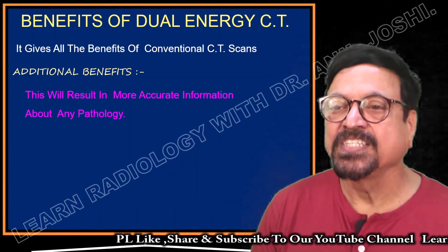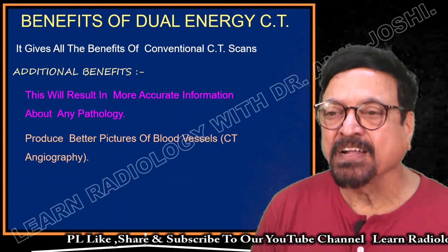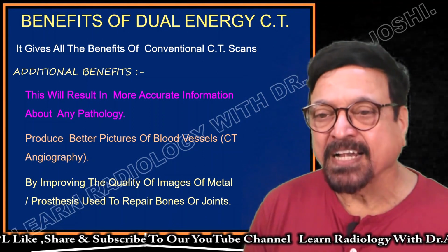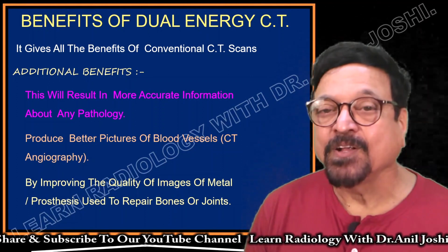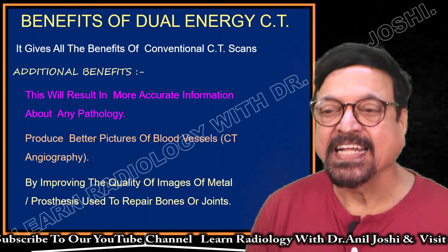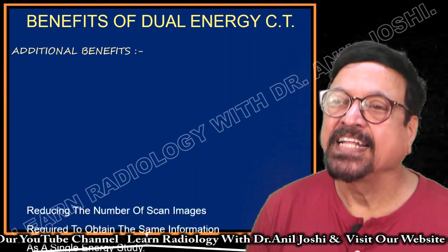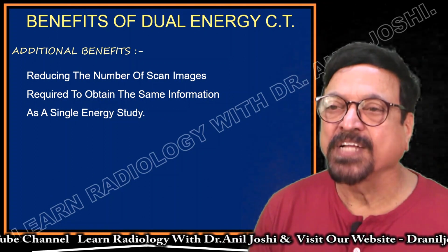Additionally, this will result in more accurate information about any pathology, and a better picture of the blood vessels, particularly in CT angiography, by improving the quality of images of the metal prosthesis, because there is less artifact. I will not say no artifact, but there will be less artifact, which can be filtered, and you can get an image in a fairly diagnostic form.